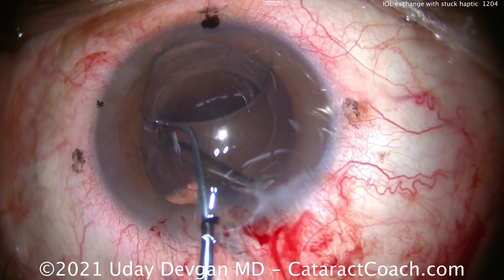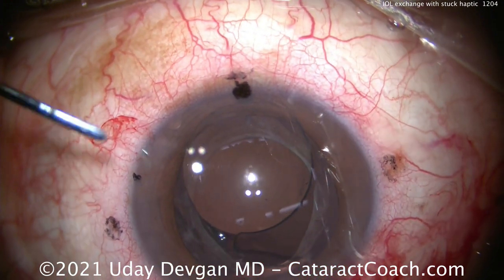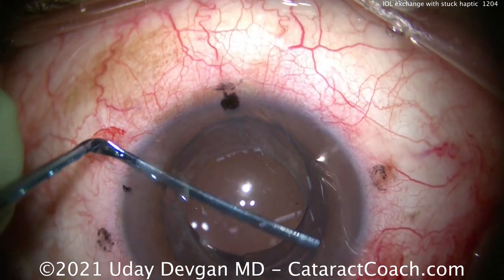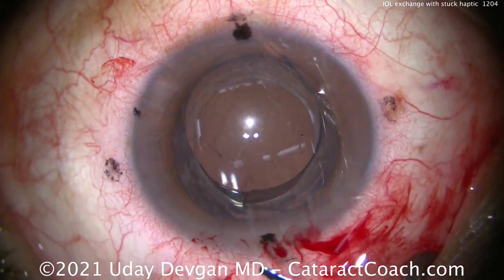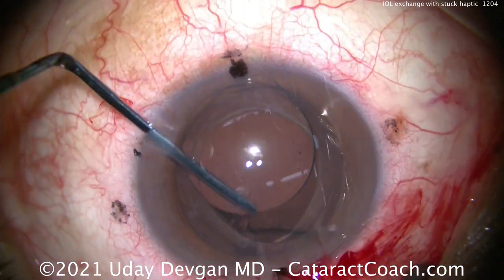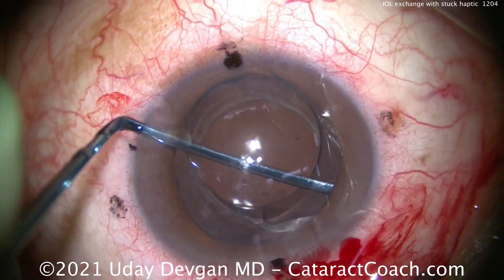We can bring that up out of the capsular bag. But look at the other haptic — the one that's inferior on your screen, which is the patient's superior. So let's try to dissect a little more in that quadrant. Is that enough? Nope. Look, it's still attached. There are still adhesions to that bulbous tip. So we'll do it again.